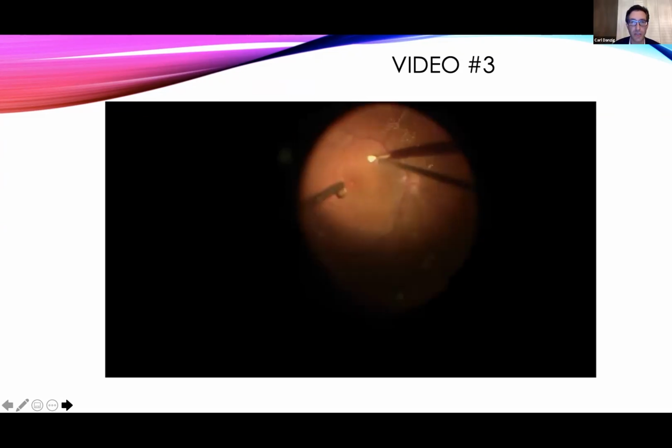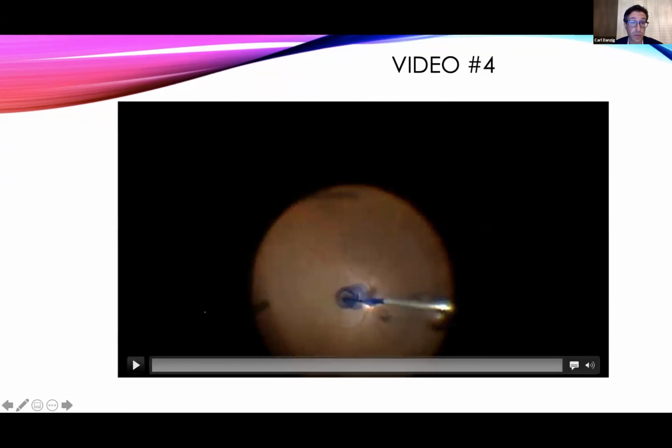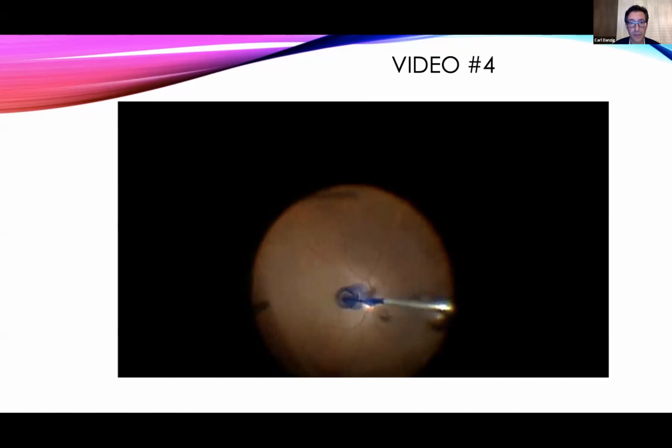But I haven't noticed any difference in terms of its actual effect on peeling itself. Carl? Yeah, I'm the same way. I didn't have so much of an issue with ICG in doing that. I don't switch once I use Tissueblue to reintroduce ICG into the eye. I find that if I use a membrane scraper, then I can find an edge and then restain with Tissueblue, and it works out nicely there. So again, I find that the ILM comes up pretty much equal between both. I never found that ICG was a better agent at finding an edge for a difficult ILM. So I've been happy with both in that regard, but I like the safety of Tissueblue.